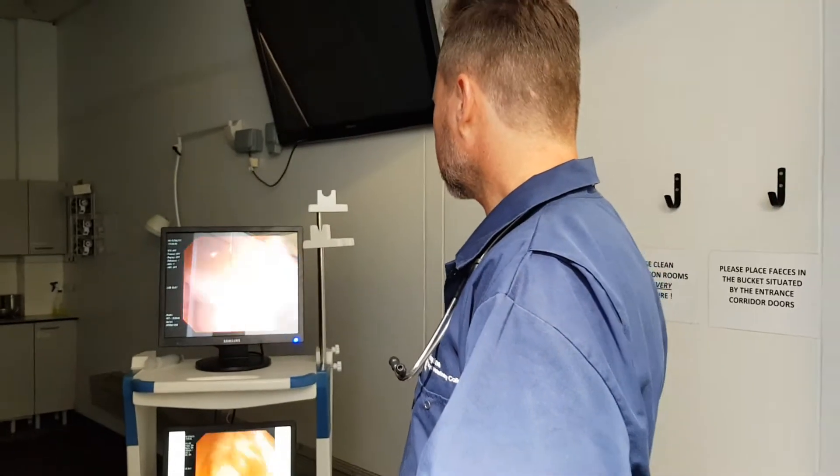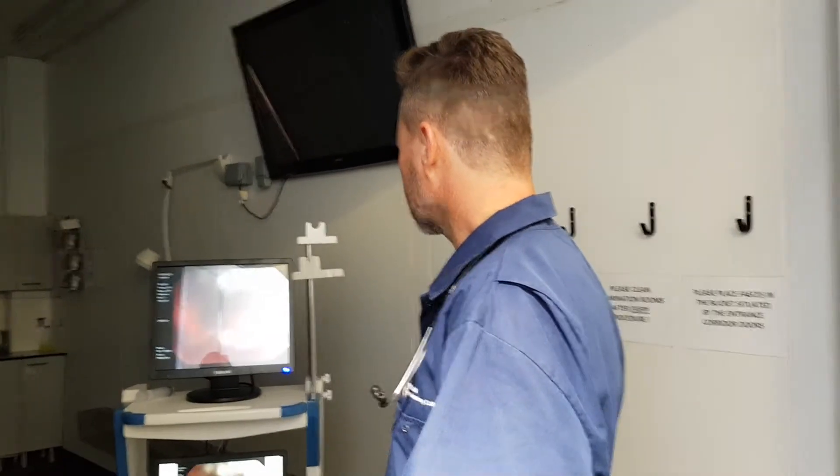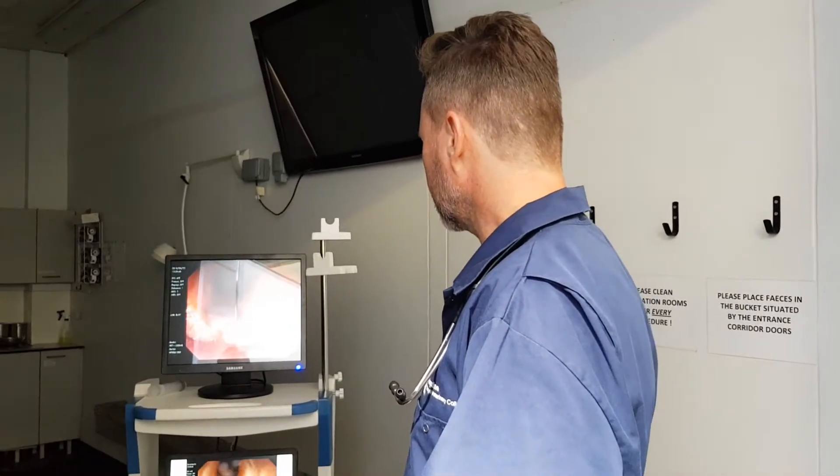I'll come back a bit for you. I'll tell you where. Just keep it in the right spot. I'll just clear the screen. It seems to clear very nicely.